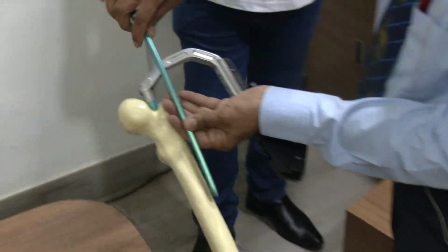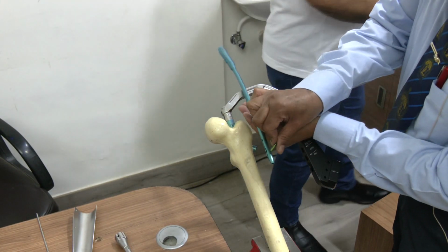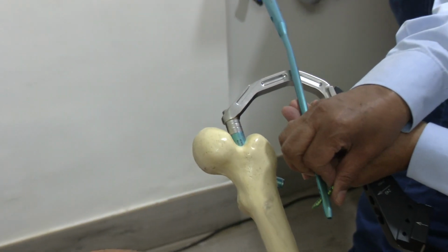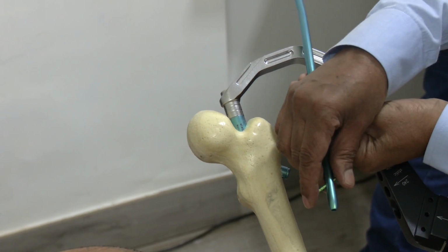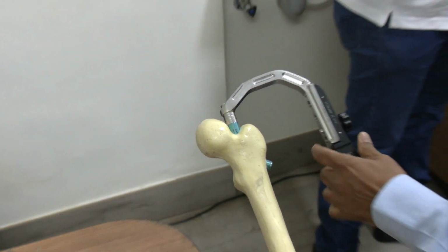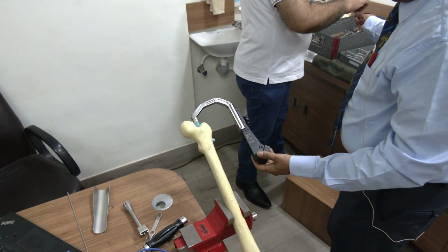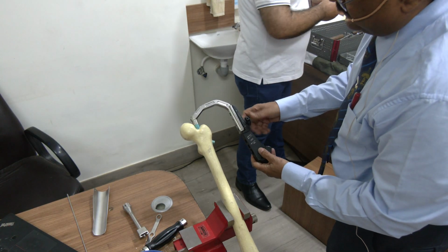Think that this is a shorter nail I am doing. By passing a bolt from here, you can do a static locking in this fashion. But as I said earlier, I don't like static locking. I will only do distal dynamic locking. So what I'll do is, I take out this jig and attach the dynamic locking jig.